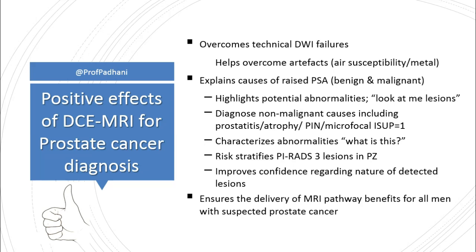My view is that currently the use of contrast medium enhancement helps to ensure the delivery of the MRI pathway for men with suspected prostate cancer.